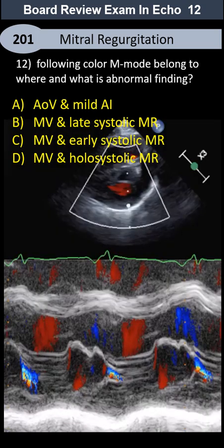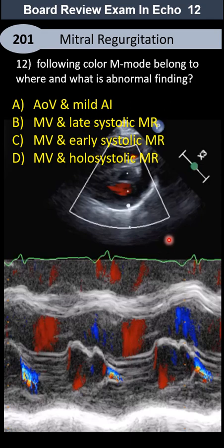The following color M-mode belongs to the mitral valve — what abnormal or positive finding can you see on this one?